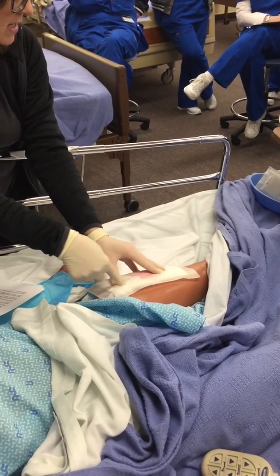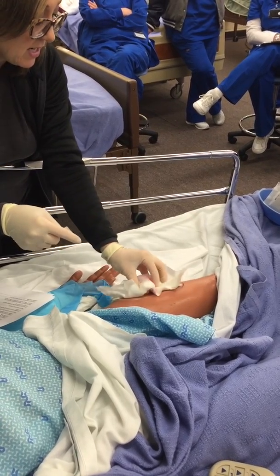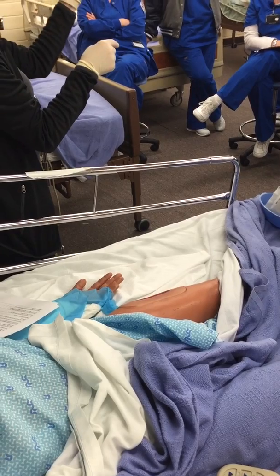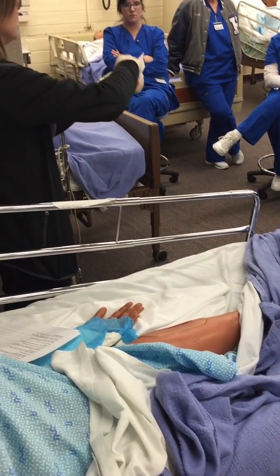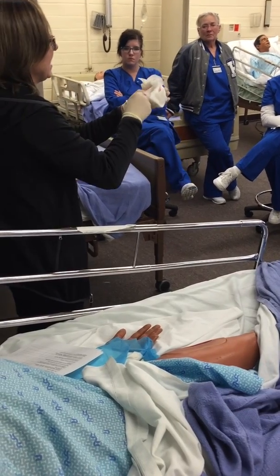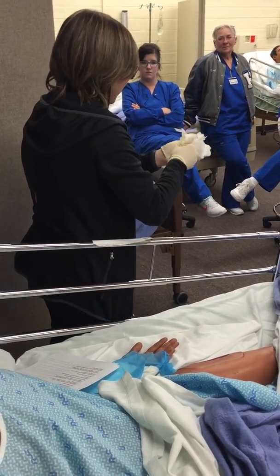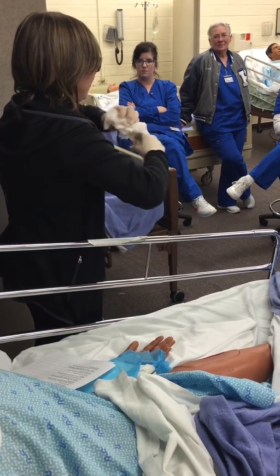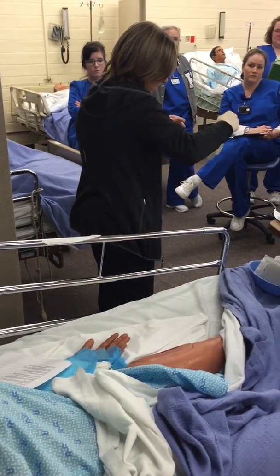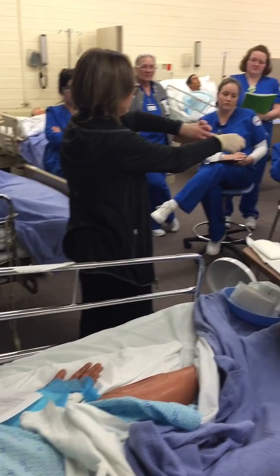Next thing I'm going to do is, do I want to flip all this junk everywhere? No. So I'm going to grab everything in here and kind of do like this, and I have everything all in a ball right here. And then I'm going to grab right here, not underneath. I'm going to grab right here, and I'm going to pull like this and take it off. And then I'm going to dispose of that.